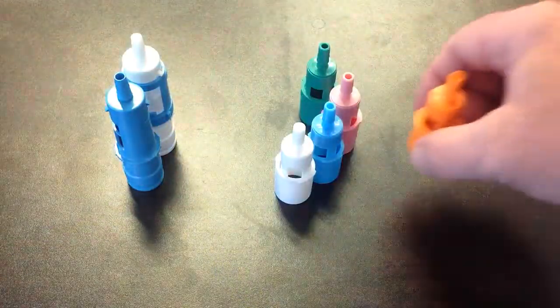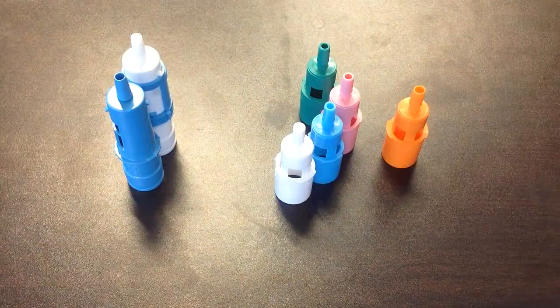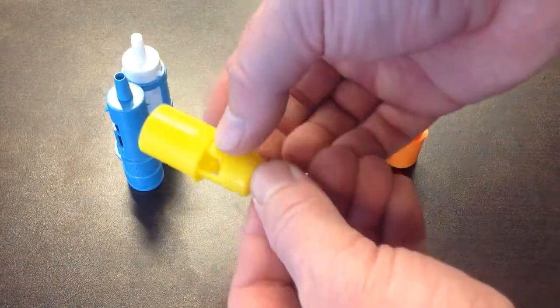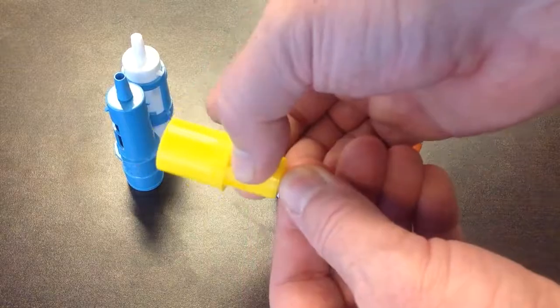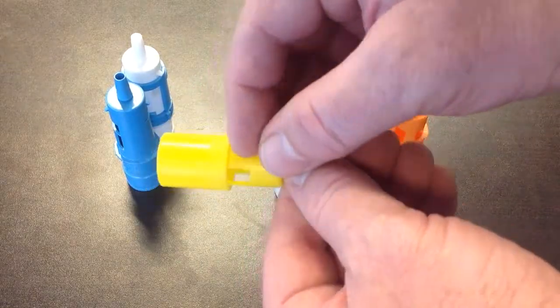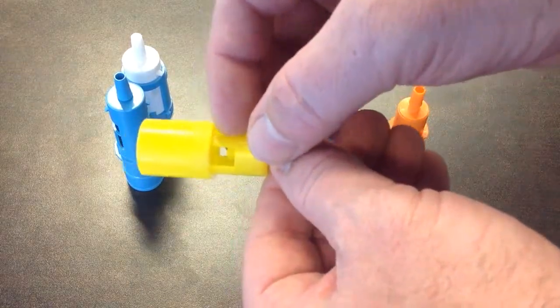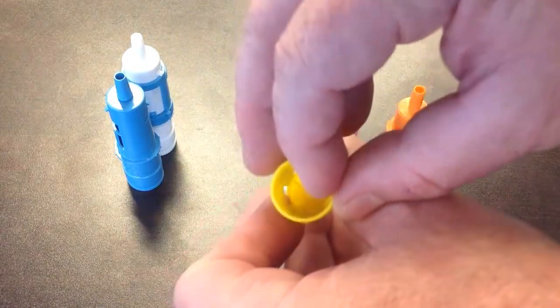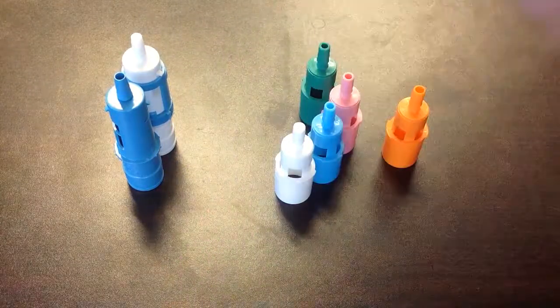Okay, what do you need to know about this, how to use it? Just to give you some historical background, the jet goes through, causes negative pressure in here, which then sucks room air into these holes, into these ports, which will then dilute the 100% oxygen that's coming from the wall down to the exact FiO2.